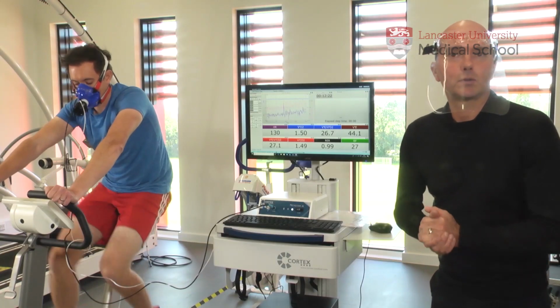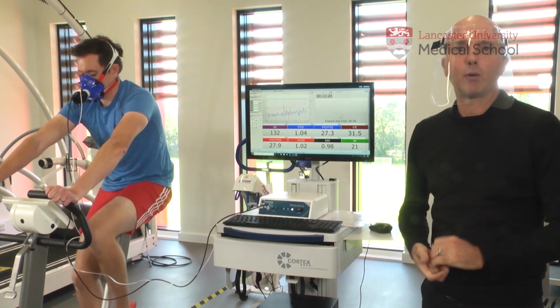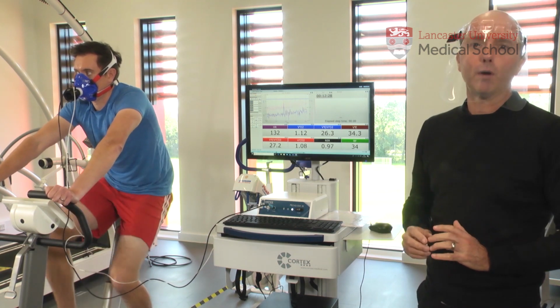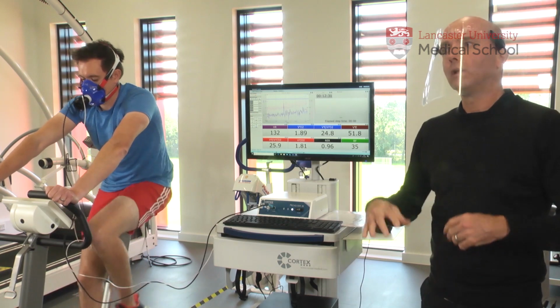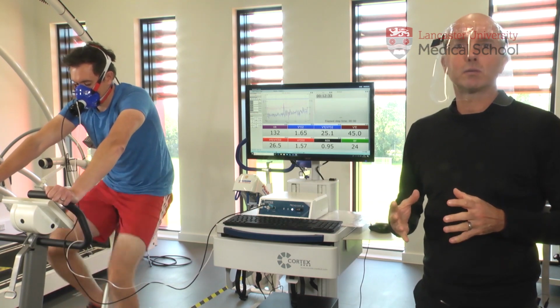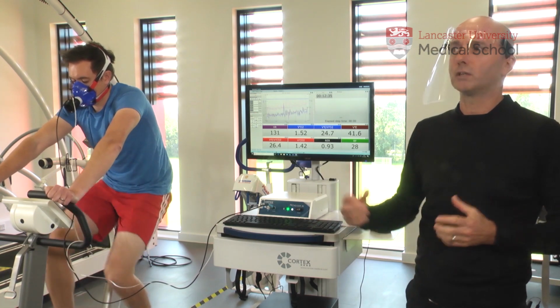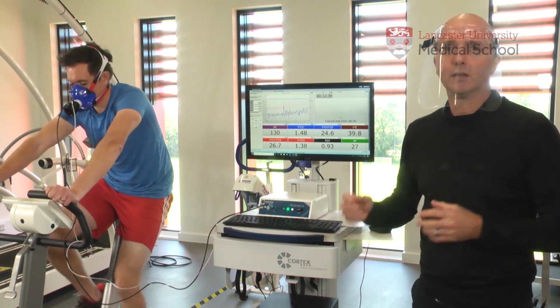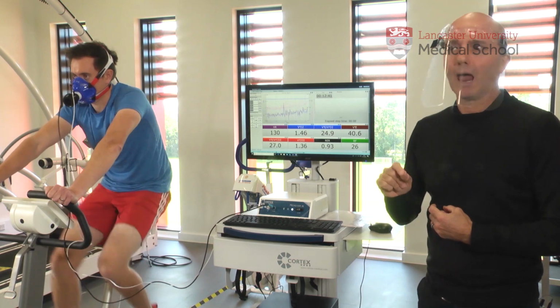The lactate threshold test should take maybe about 9 stages to get a good lactate profile. So in this video, rather than the 40-minute test showing every stage, we'll condense down the sections and move to the end of the test to start having a look at the lactate building up when intensity gets high.